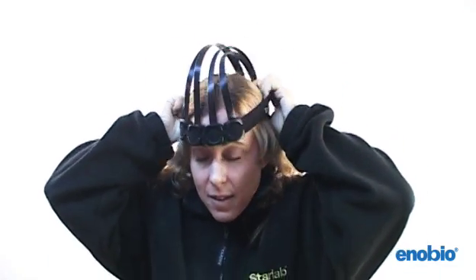This is the Inobio device here which has been preassembled. I'm going to place it on my forehead. There are four electrodes and these electrodes work dry without the application of any gel.